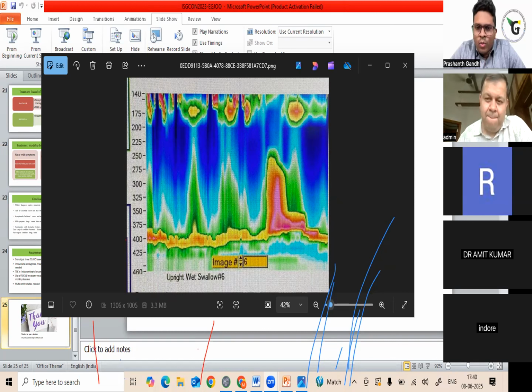Sir, when we try to dissect different subsets of patients with EGJ outlet obstruction, what is that thing which segregates a few patients as abnormal or normal after shifting from a supine to sitting position? What are those few things, like say hiatus hernia or whatever could be the added reasons? Why does it become normal IRP if it's not EGJ outlet obstruction?